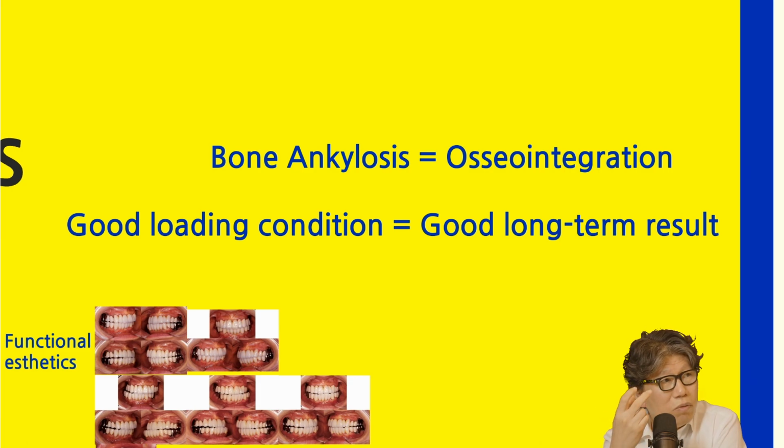So macro threading, micro sanding, or acid treatment, creating a nanosurface of these structures so that the intimate contact can withstand the loading conditions. Those implants last longer, and those that don't, they don't last as long.